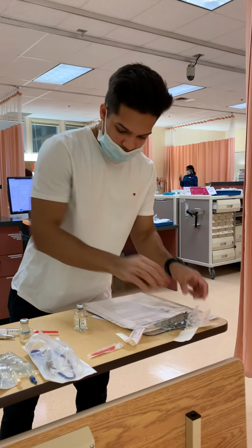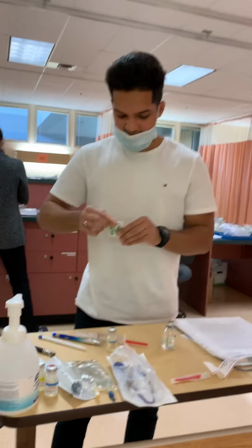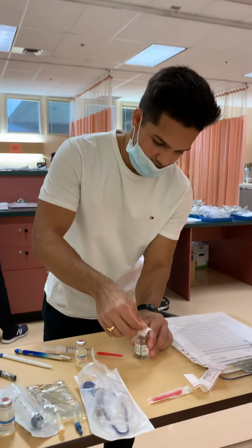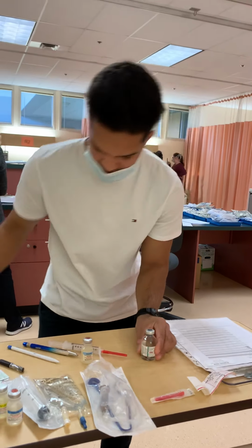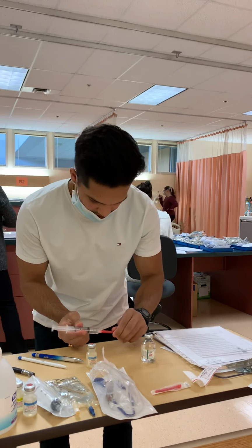I'll be taking the alcohol swab, wiping the top of my vial for 30 seconds, letting it dry for 15. 4 milliliters of air.